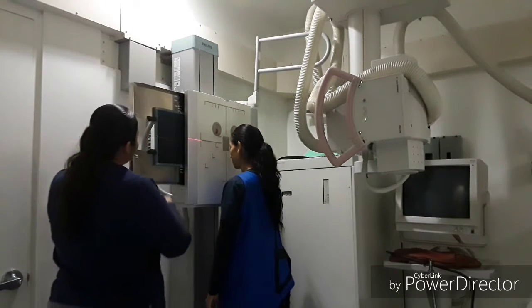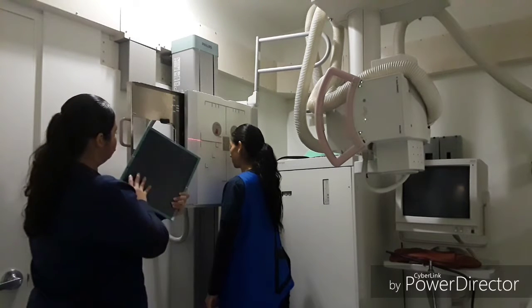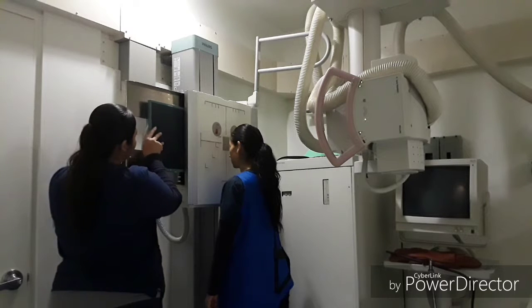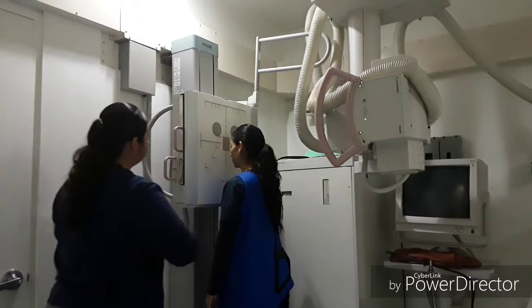I will change my IR, bring in a new one, and I'm going to change it to a portrait. And I'm going to change my marker to left.